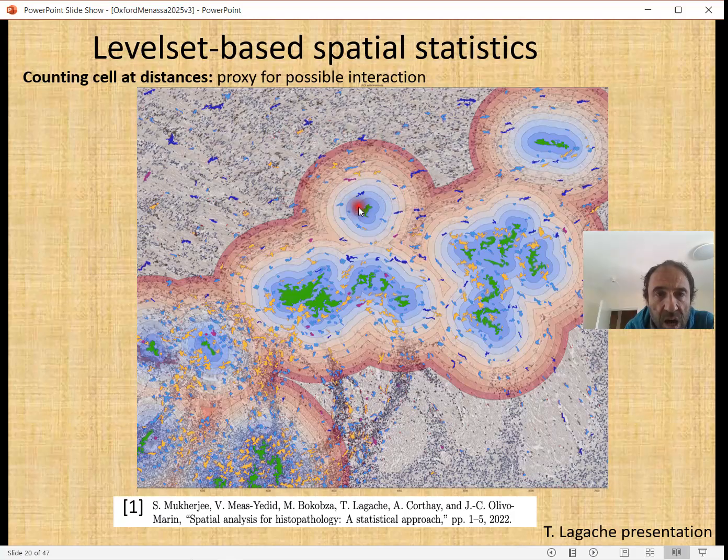So you can see how, from a cell like this, the cell is surrounded by microglia of another type. And this is a very convenient way to look at the local neighbors of a given cell. Here I showed one, but you can see the other ones and see what the neighbors are and how the cells are aggregated around one type of population.